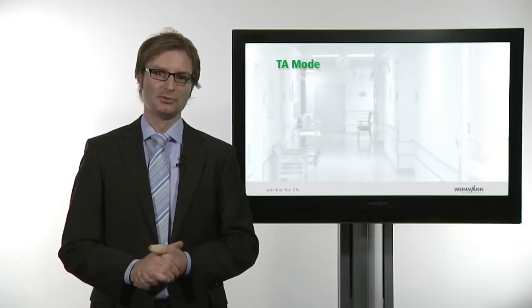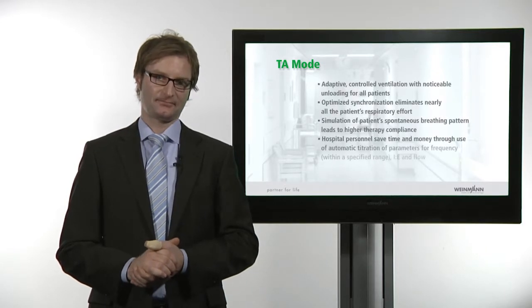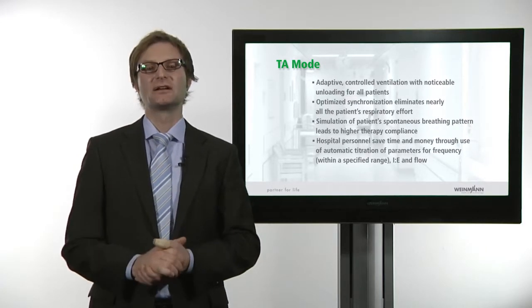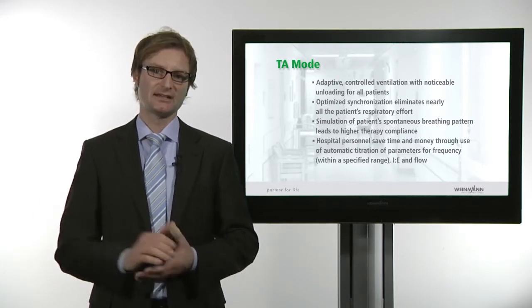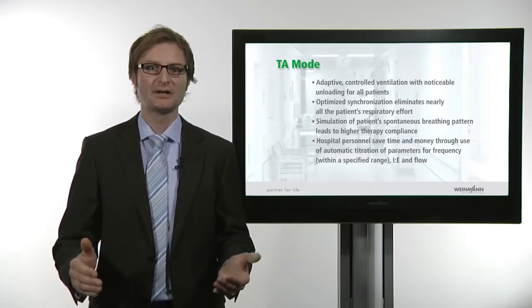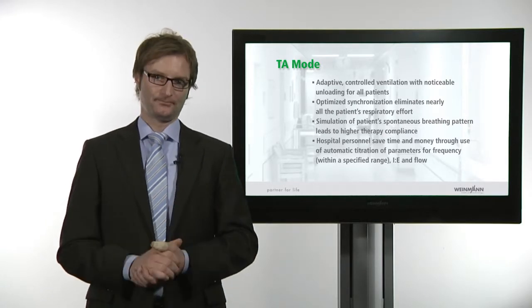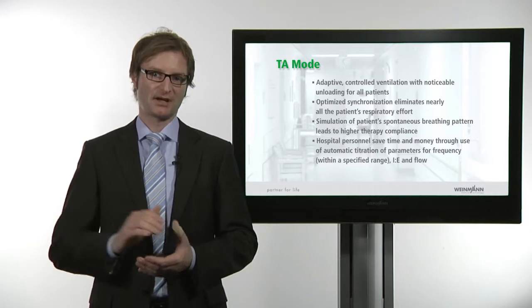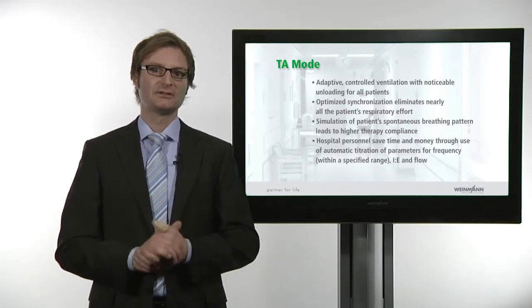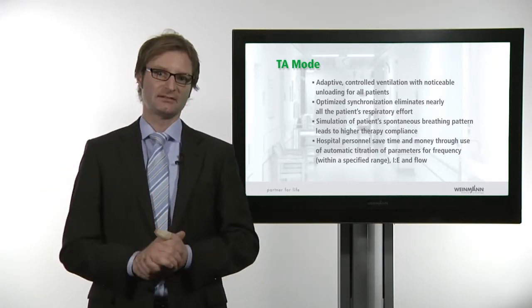Here is a brief summary of the advantages of TA mode. TA mode permits controlled ventilation based on the patient's spontaneous breathing pattern. The work of breathing is reduced to almost nothing. Hospital staff can save time and money as the parameters are automatically titrated anew when the patient's breathing pattern changes.